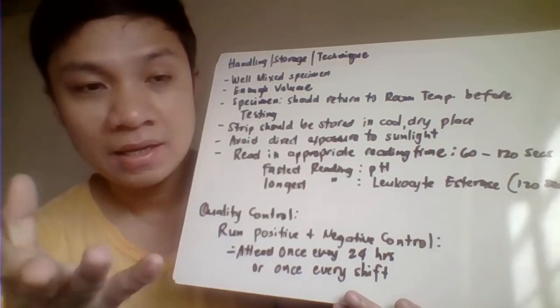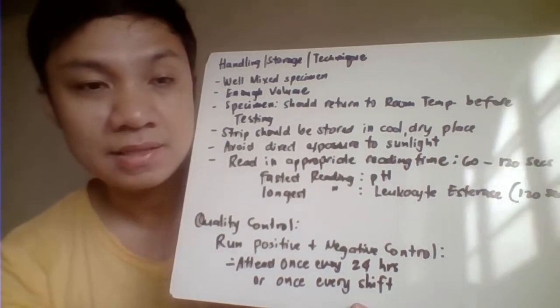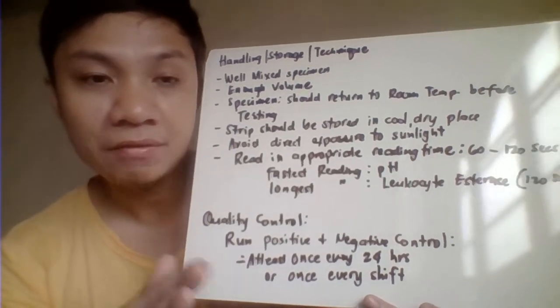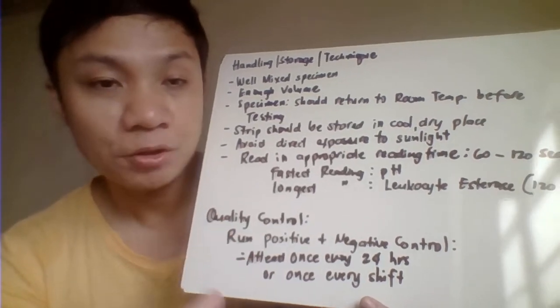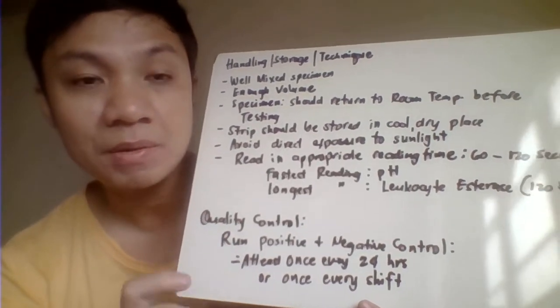Because if your urine sample has already sat for a long period of time, some of the cells have already settled at the bottom of your specimen container.